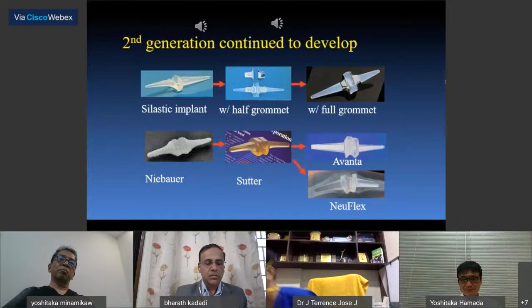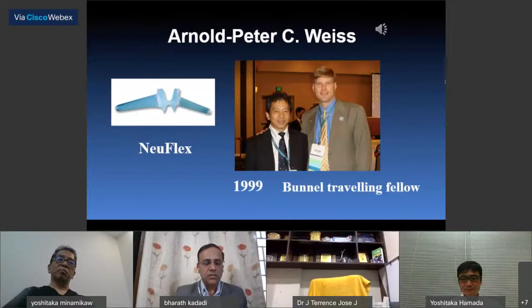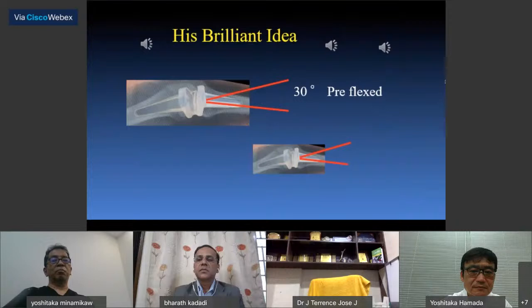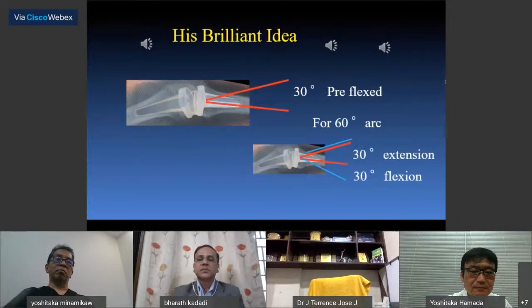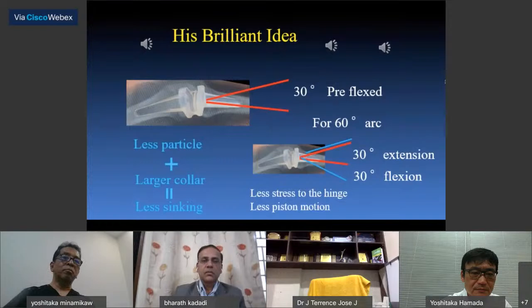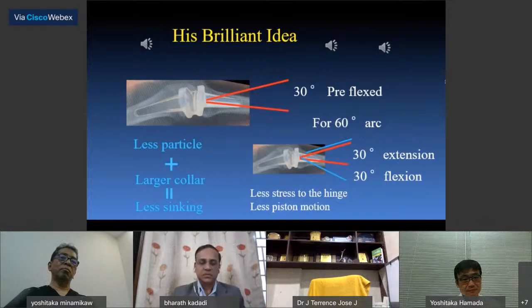The NeuFlex implant, a preflexed design by Arnold-Peter Weiss, was reported in 1999. He came to Japan as a Bannerman Traveling Fellow and presented his early experience. His brilliant idea was that for 60 degrees of motion, you need 30 degrees of extension and 30 degrees of flexion. This decreases stress on the hinge, reduces piston motion, and improves functional range of motion. Also, minimizing abrasion means fewer particles, and a large collar design leads to less sinking.